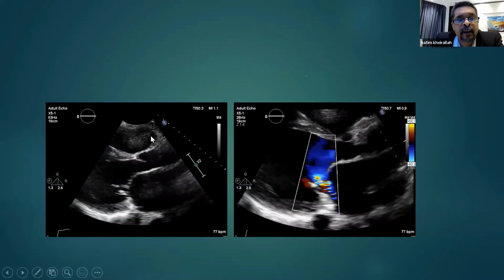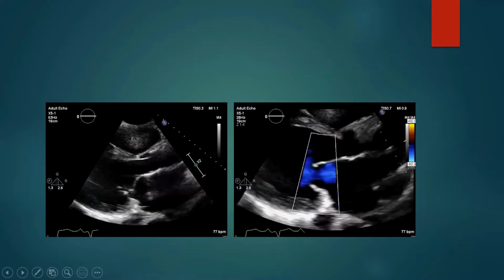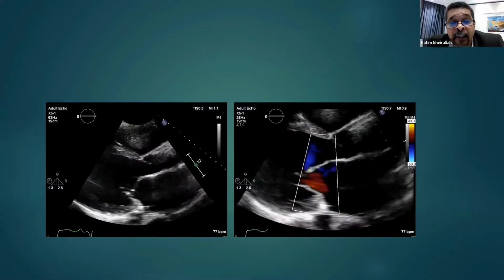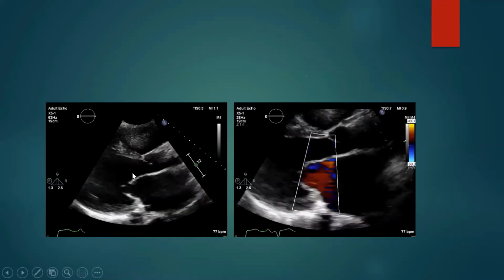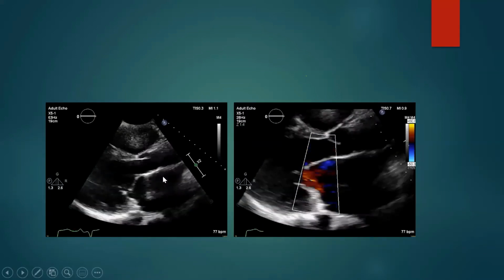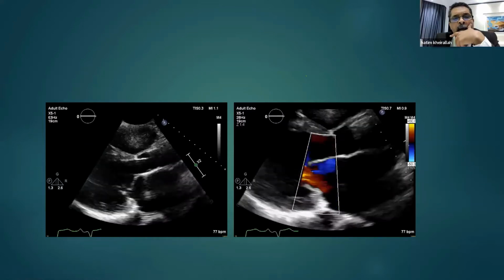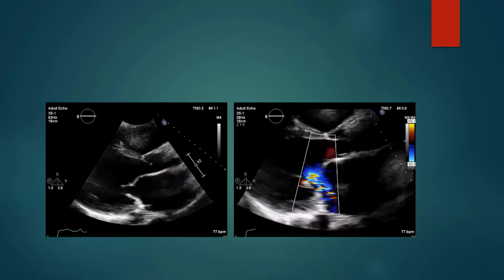If you see here, I think this is typical. This is so typical. Are the clips moving slow? Are the images moving slow? Do you have the same problem with the images? I thought maybe it was a network problem, but do all of you have the same problem? Yes, some slowness.